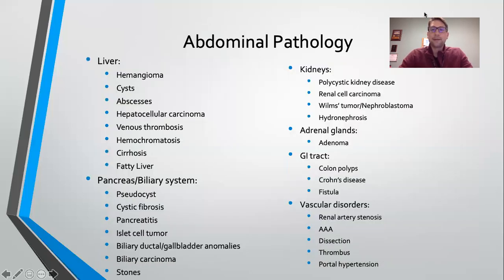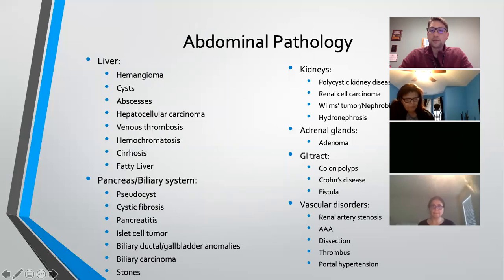All right. So the last bit of the PowerPoint is a bunch of pathology. I'm not going to go over that, but I want you to flip through these remaining slides so that you know it for the exam. But these are all the abdominal pathology that you might run into while you're scanning abdomen.